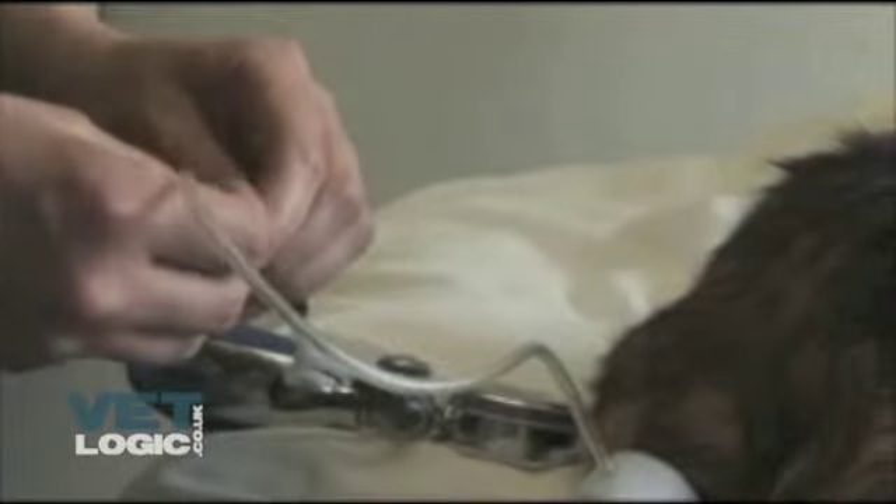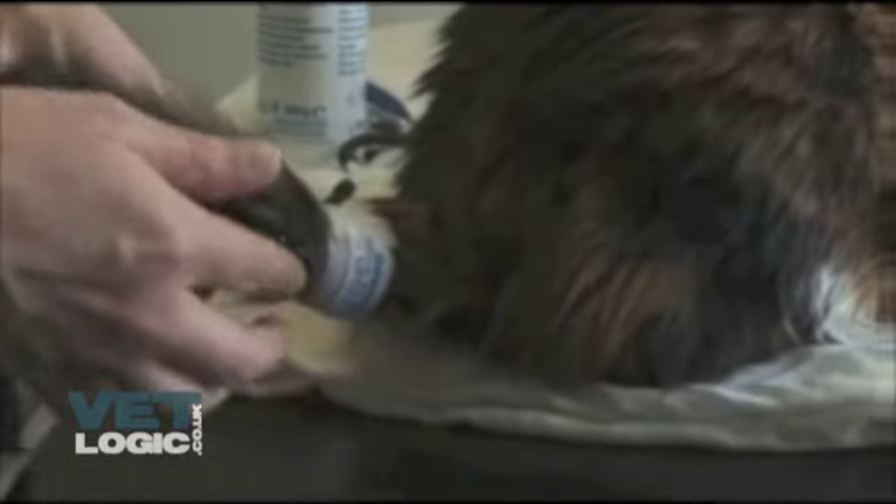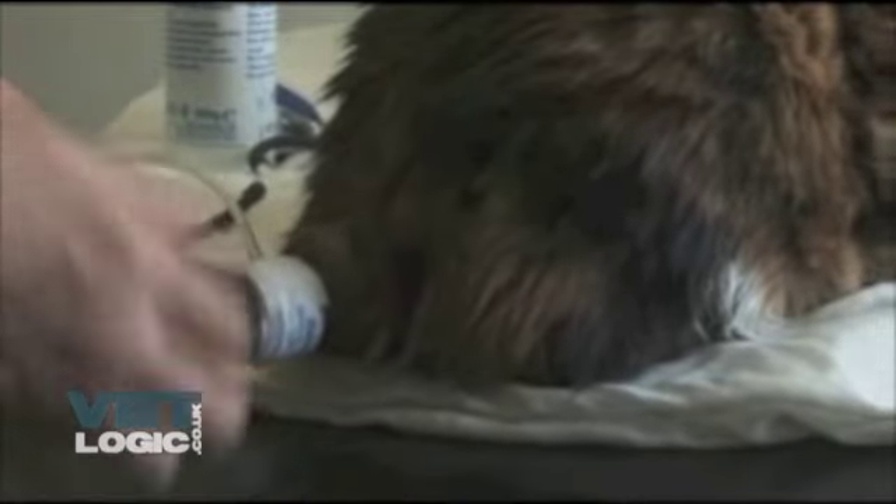Because the tail is generally more dense with fur than the forelimb, parting the hair to dampen it down with surgical spirit is recommended. Plenty of ultrasound gel should also be used. Clipping of the hair is very occasionally necessary if finding the pulse is too difficult.